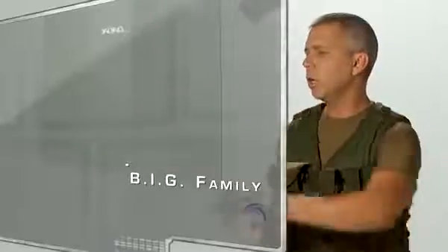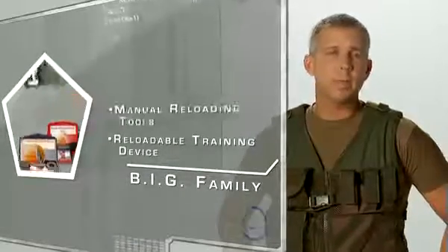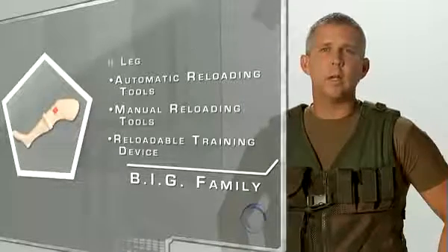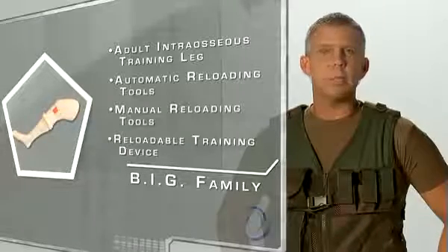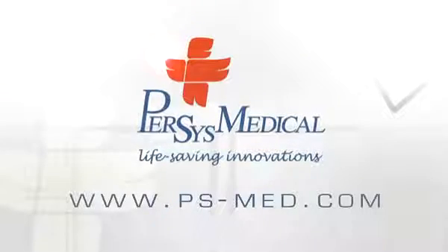The Bone Injection Gun family of products includes reloadable training devices, manual reloading tools, automatic reloading tools, and the first-of-its-kind adult intraosseous training leg complete with replaceable skins and simulated bone cartridges. To learn more about these products, contact us at www.ps-med.com.